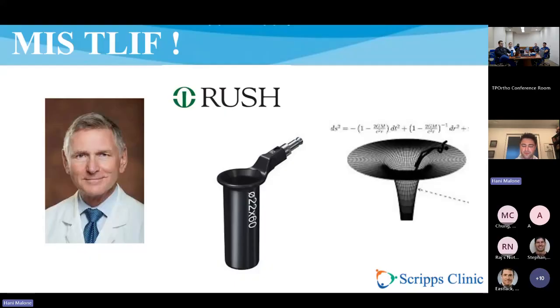And the fact that the tube is round confers a number of benefits in the way that it retracts tissue and minimizes soft tissue destruction. So I think that if you're going to do a TLIF, unless there's a revision or some other good reason not to, the MIS route is definitely the way to go. Obviously, if it's in the context of deformity or something else, it's a different animal. But presuming it's a degenerative 1-2 level TLIF, I strongly advocate for the tubes.